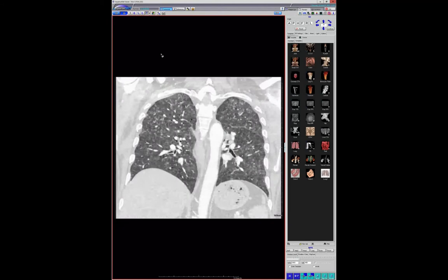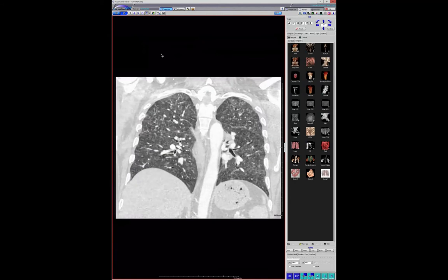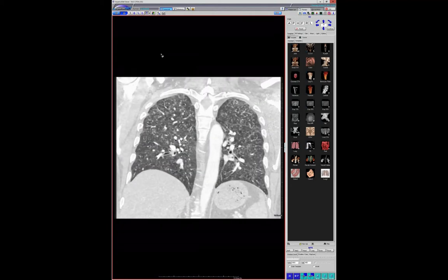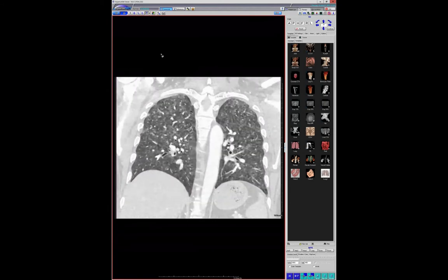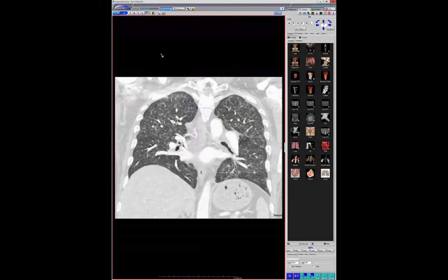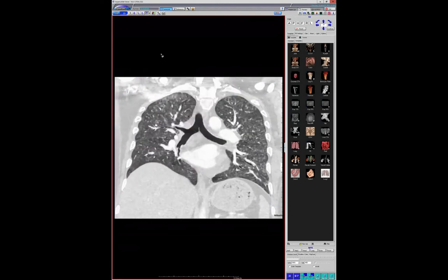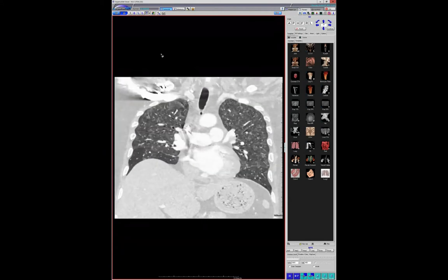So this is actually DAD pathologically here? Well, I mean, there's probably a big cytokine storm, and you're connection to the lungs. So not every one of these little dots is a worm, but I think there's a lot of reaction to the presence of worms and a whole bunch of cytokines, and these people go into diffuse alveolar damage and die. Yeah, I thought the dots were more likely hemorrhage related to the worms, but maybe it's not. Again, this is complete speculation. I don't know. And maybe it's related to cytokine storm, like you said.